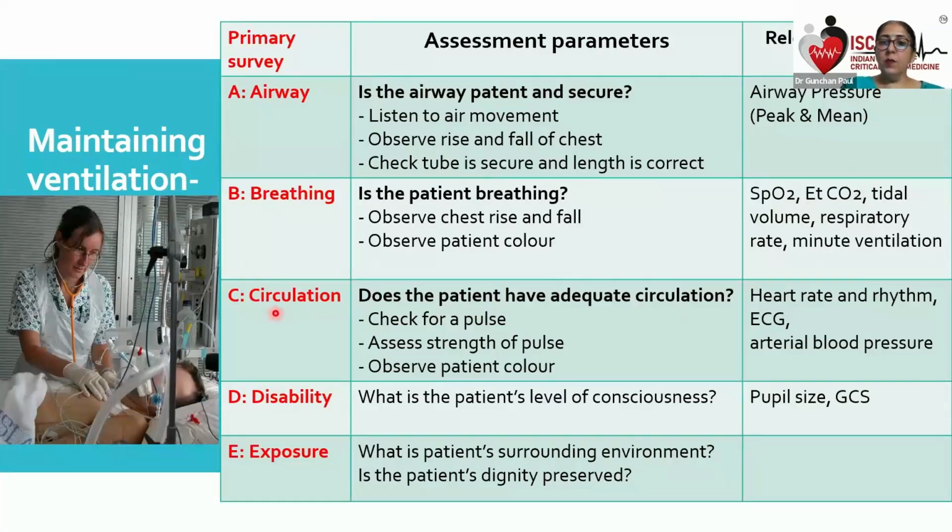Look at the circulation. The patient is pink. He has not become blue. His heart rate has not fallen. What is his ECG? What is his rhythm? What is his blood pressure? What is his level of consciousness? If the tube is blocked or dislodged, what is his response, and what is the patient's environment? You have to take care of the dignity of the patient. So any problem that comes, the first response is by the staff.